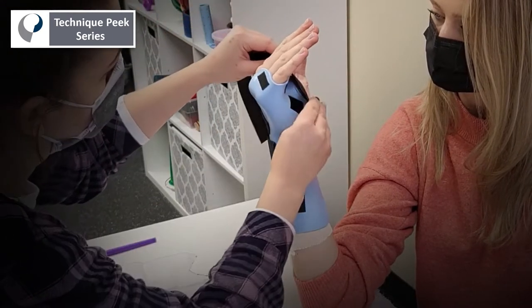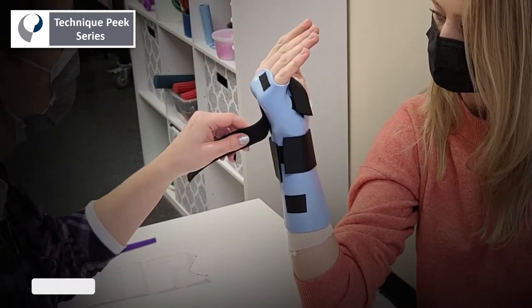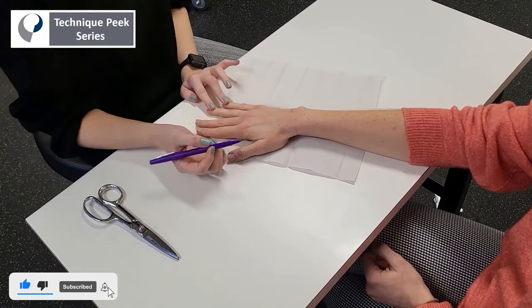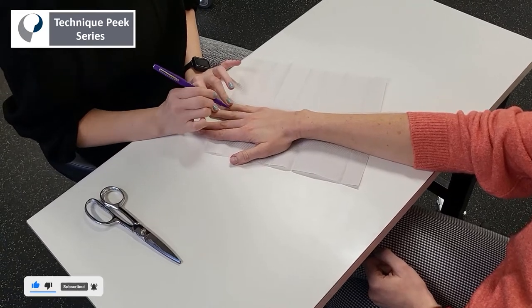Today we're going to review how to make a forearm-based ulnar gutter splint. Starting with the pattern, you're going to mark the PIP joints of the fingers you wish to include in the splint — in this case, the fourth and the fifth digit.